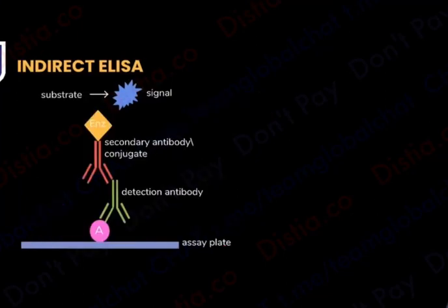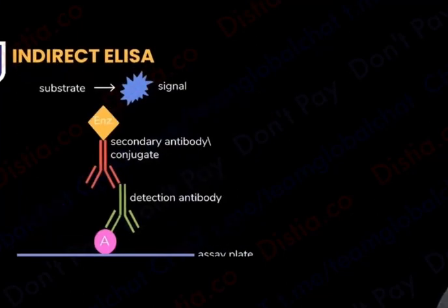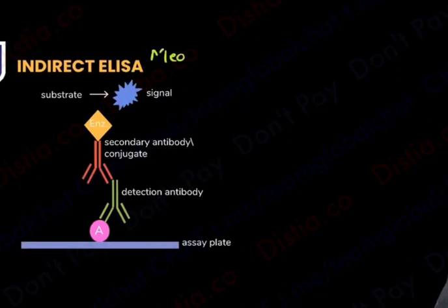But what is indirect ELISA? In indirect ELISA, what do you want to test, guys? In indirect ELISA, you are basically going to measure the antibody.